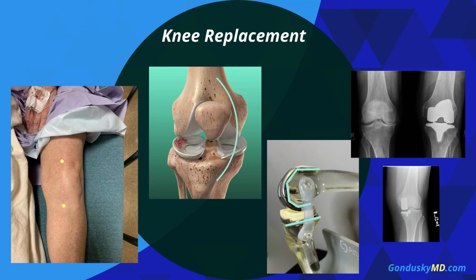So let's discuss what I do when I replace a knee. It's really simple in theory, actually. I always tell people it's really not too hard to replace a knee, but it's really an art and a challenge to make each one as perfect as possible. Everybody's knee is a little bit different. People have different deformities, different angles of contractures, different soft tissues.